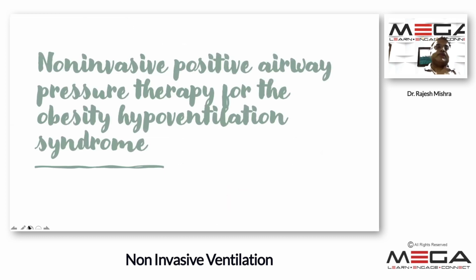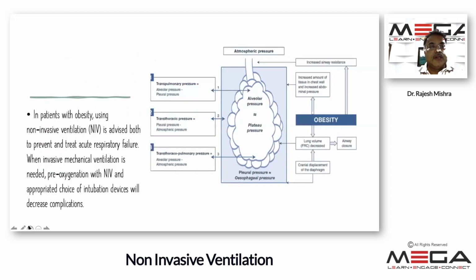Non-invasive airway pressure therapy for obesity hypoventilation syndrome has a role in chronic patients, or if they have acute decompensation, or even as home therapy. We know that all these patients need some kind of CPAP support to avoid their sleep apnea, and even after that, they continue to have alveolar hypoventilation. They not only need CPAP, but they need additional BiPAP. But 90% of the patients respond to CPAP.